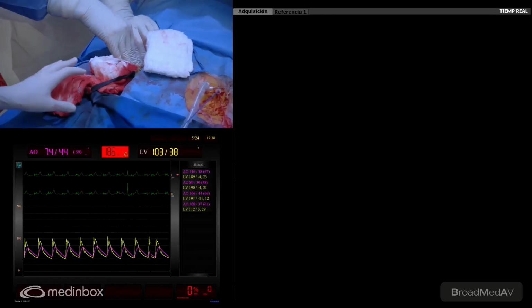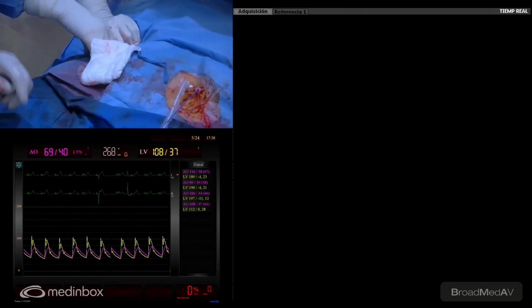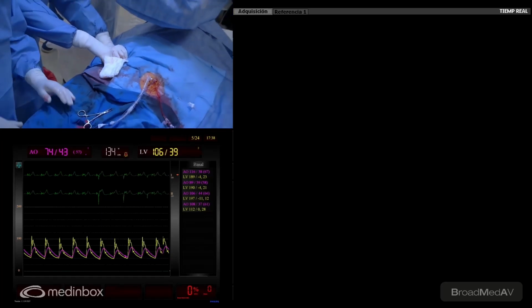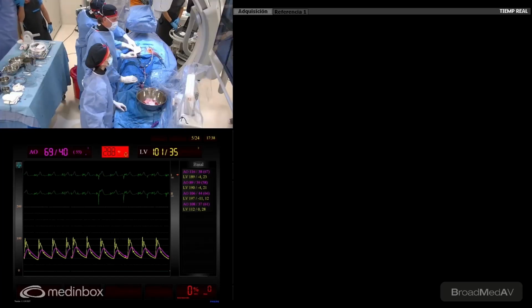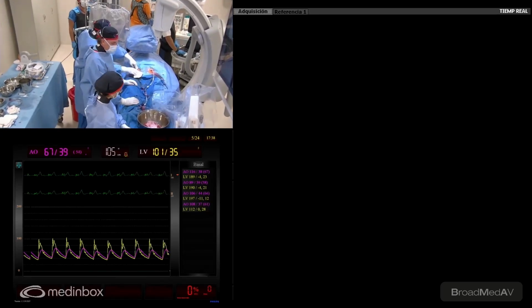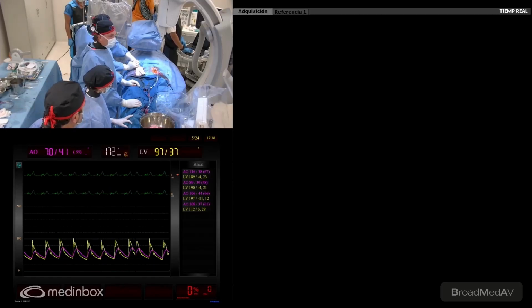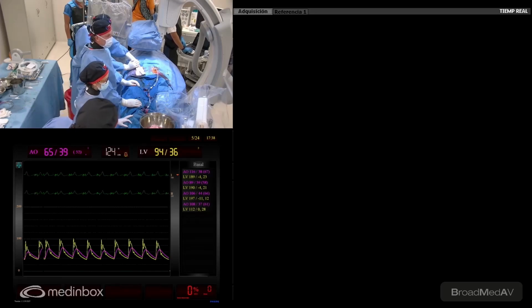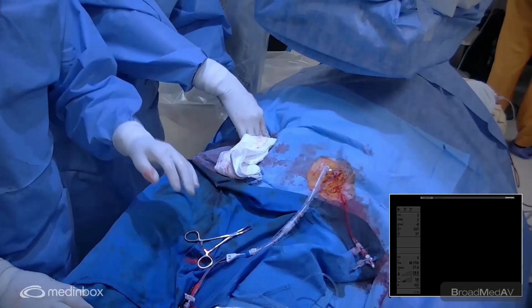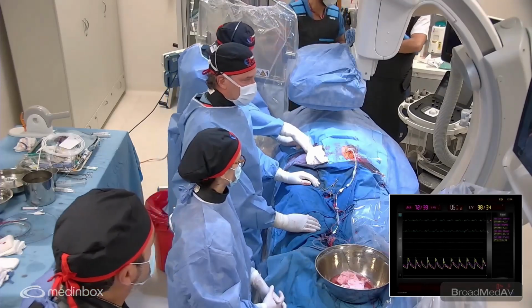Yeah, the blood pressure is 100. No, yeah, 96, pero podemos subir un poco más. So we still have 5 or 10 minutes. This case is done. We will hold the groin to get the perfect sealing. We will test once more to be sure that we don't have any kind of bleeding. And then we will leave the wire in the right ventricle for pacing. And we will call our colleagues to keep this patient in mind and to decide probably tomorrow morning to put the pacemaker if this conduction disturbance does not disappear in the next 12 hours or something like this.